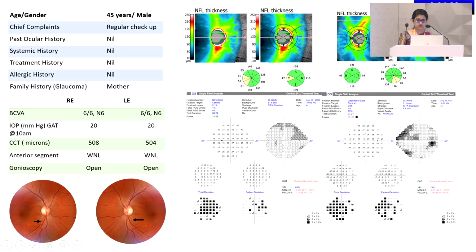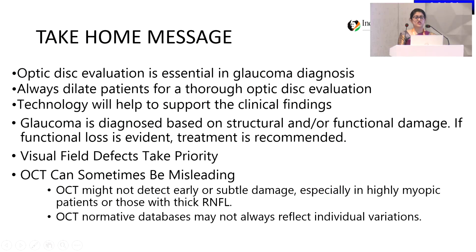for this patient. So the take-home message will be optic disc evaluation is essential in the glaucoma diagnosis, and the dictum is to dilate each and every patient who walks into the glaucoma clinic. Also remember that technology is just to support our clinical findings, and relying too much on technology solely can often be misleading.